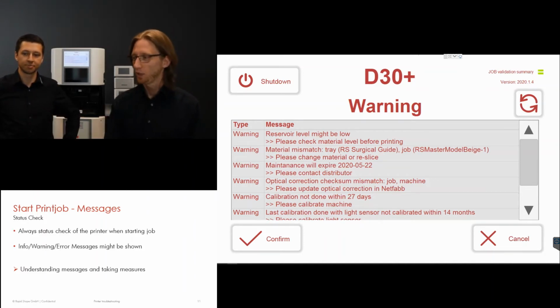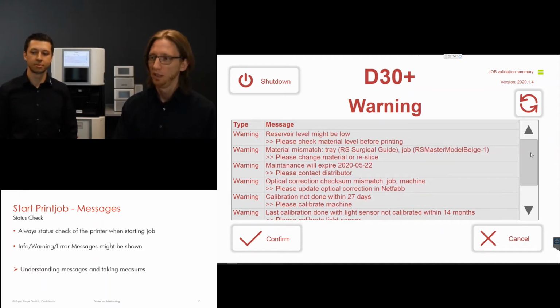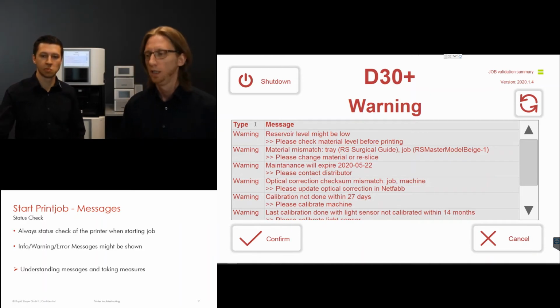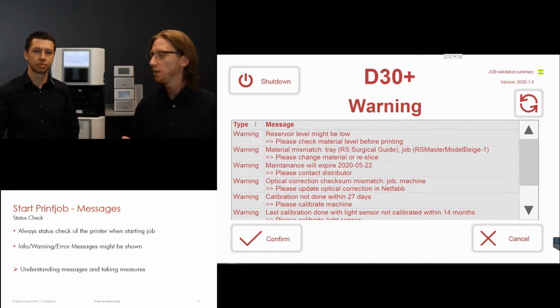We could have different levels of, let's say, messages that can appear on the screen. We could have 3 different types. It could be information only, it could be a warning, which we can see here on the screen now. And for Straumann customers, we could also have error types. So error types are the only ones you cannot override.